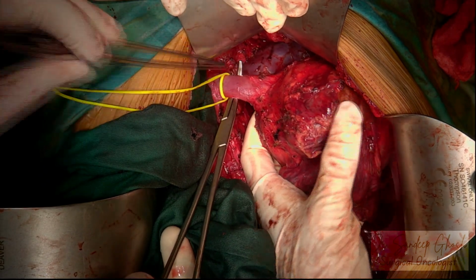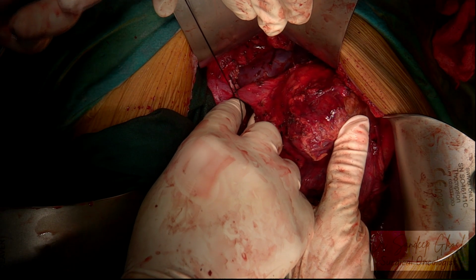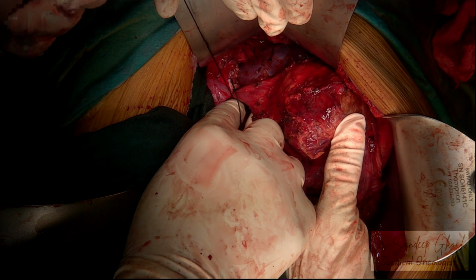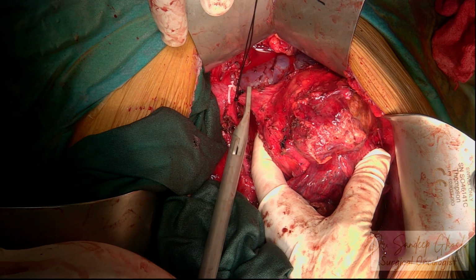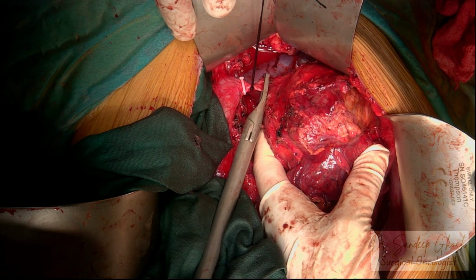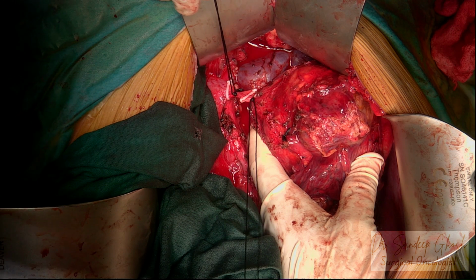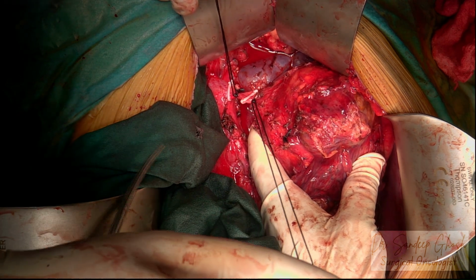Now the last structure to be ligated is the left renal vein. The Hem-o-lok clips being applied and cut in between the ligatures.